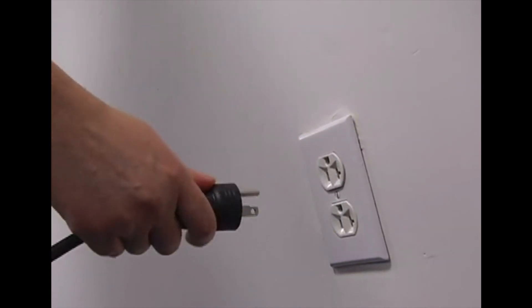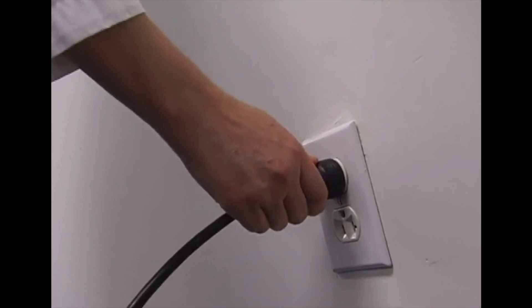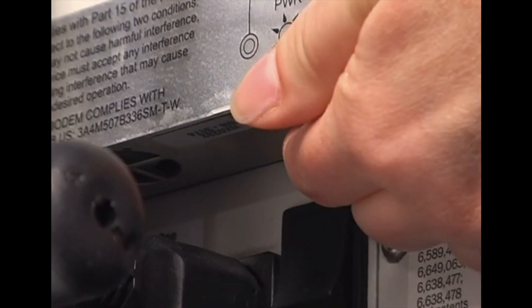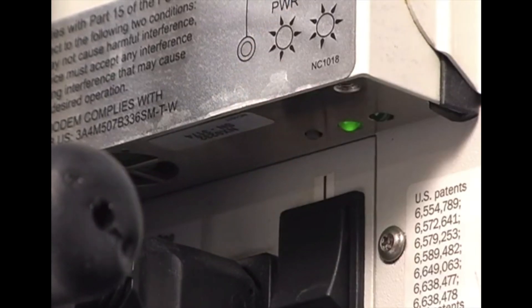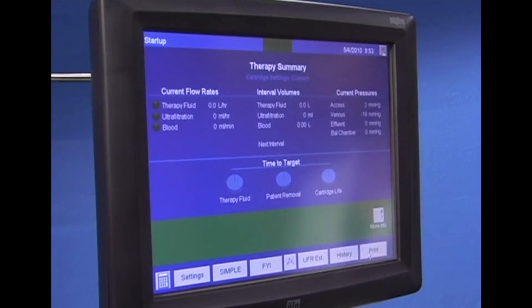You can remove the power cord from the wall outlet and reinsert it, or depress the reset button on the jewel box. Wait for the standby screen, then choose new patient or current patient as appropriate.